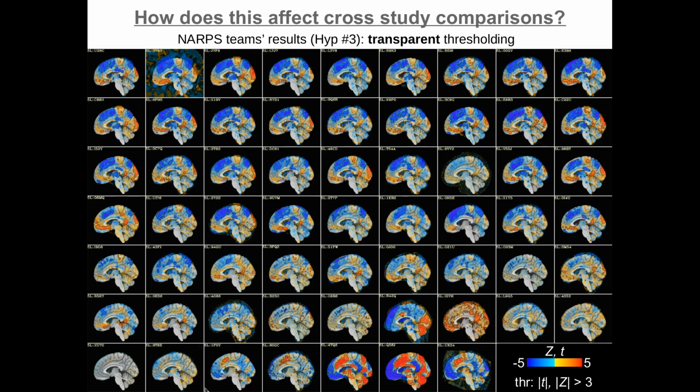And in many cases, those discussions clarified and improved the matching of these results to the other studies. So having more informed discussions and also thinking about results as contributing to a body of literature that are part of a discussion actually helps, well, in this case, help reproducibility, but in any case helps comparisons.